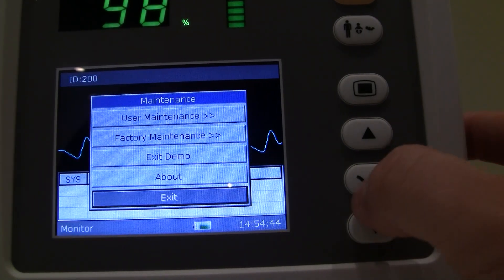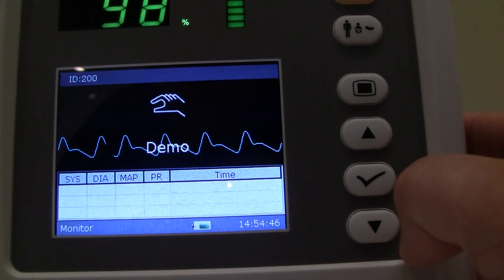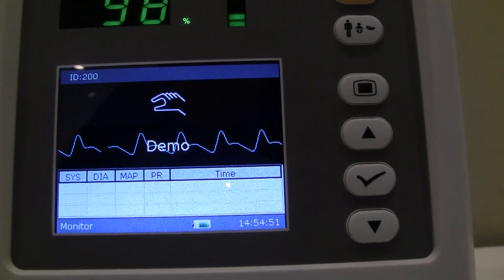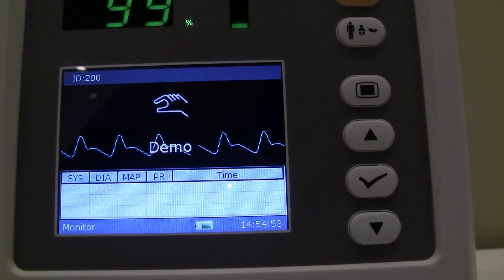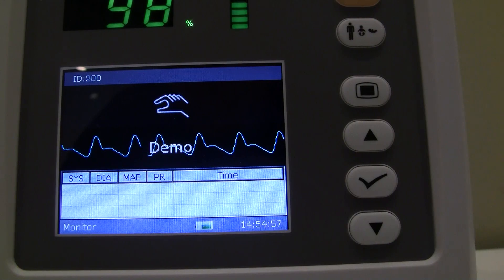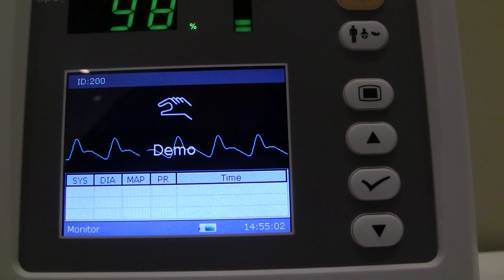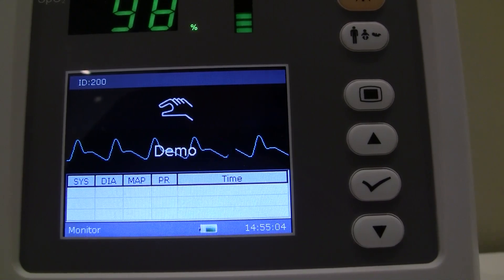Pretty easy user interface, pretty self-explanatory. If you have any other questions about this unit, feel free to call the main office at 888-850-4597. All of our products come with a three-year manufacturer's warranty, with sales, service, and support right here out of San Diego, California.